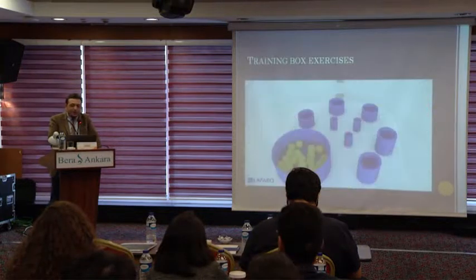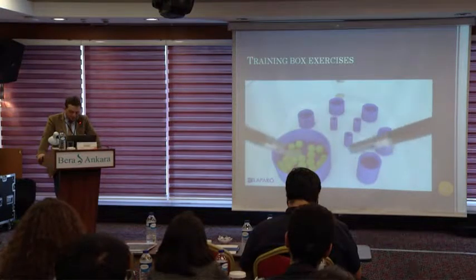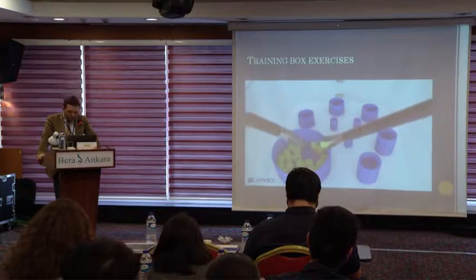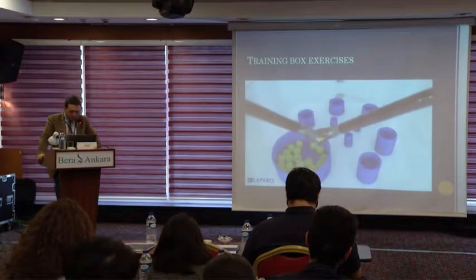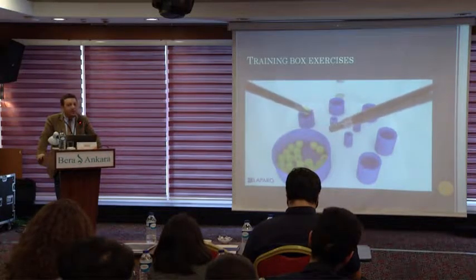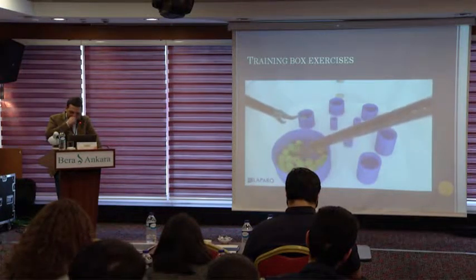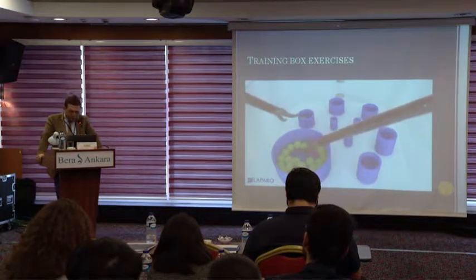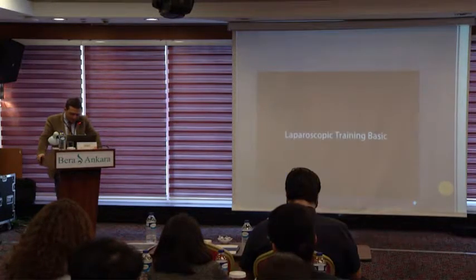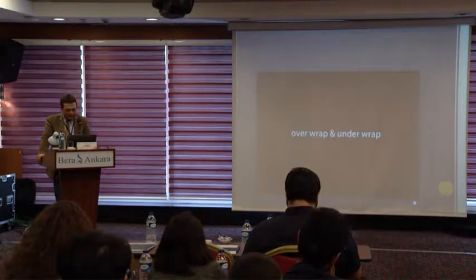And there are a lot of training box exercises on the net, on YouTube, all of them about practicing skills such as orientation in the laparoscopic environment, training of eye-hand coordination, depth perception in a two-dimensional picture, bimanual handling and manipulation of laparoscopic instruments, and correct application of the clip applier and atraumatic grasping.